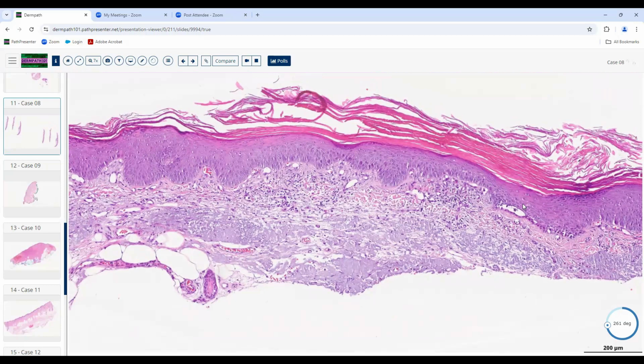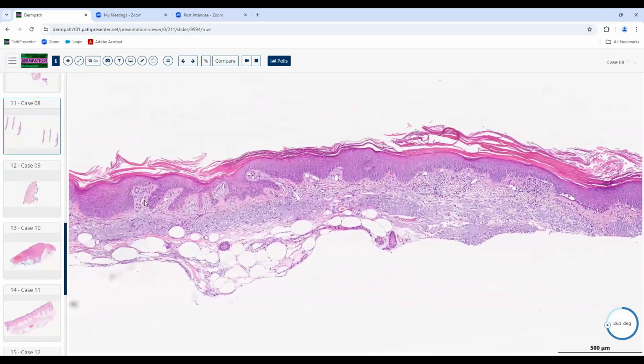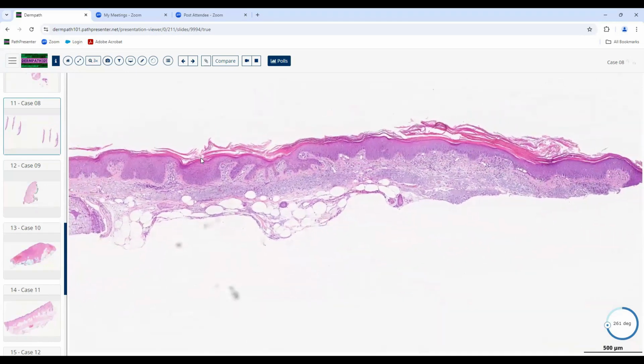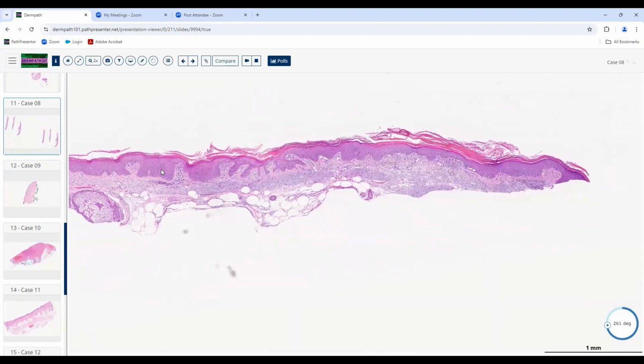And there's an old saying that you don't want to be the first dermatopathologist or clinician, for that matter, to see a patient with PRP, because you're going to miss the diagnosis, because it often takes a little while for it to sort of declare itself. But if you see these features and you're the first dermatopathologist to see it, you can be a superstar and you can make the diagnosis because you've applied these criteria that I just showed to you, and that you can make the diagnosis even if it's not an optimal biopsy like we have here. So those are the classic things you look for with PRP: the fat, blunted, acanthotic epidermal rete that is not as prominent as we see in psoriasis.